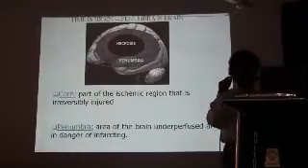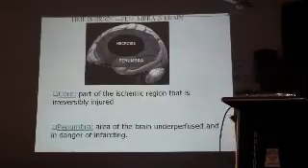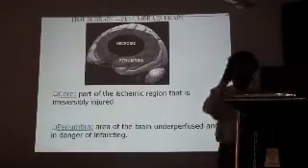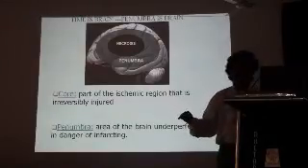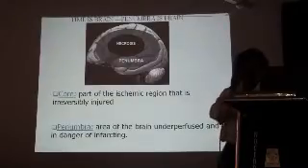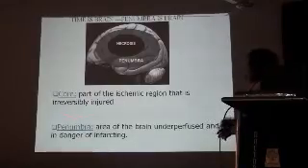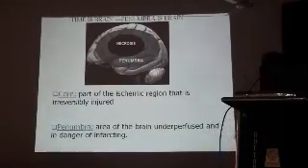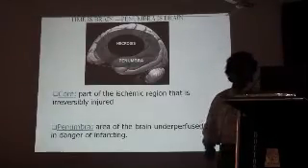Penumbra imaging is the choice of imaging that we do, because the center part is necrosis, and the surrounding area is relatively suffering ischemic change that can be reversed if you pick it up in time. That core part is irreversible, but this penumbra part is under threat and is relatively ischemic, and that can be saved.